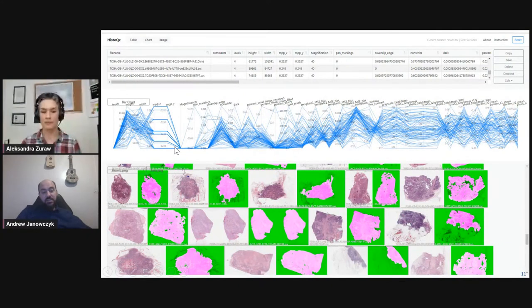And then next to it, you see a fuchsia overlay of where HistoQC has decided there's good quality slide for downstream computation. You see we've ignored some of the holes in the tissue. For my research, we really don't look at adipose tissue. So I built an adipose tissue detector and remover, like these sort of things. And if adipose is important for you, you just disable it, right?